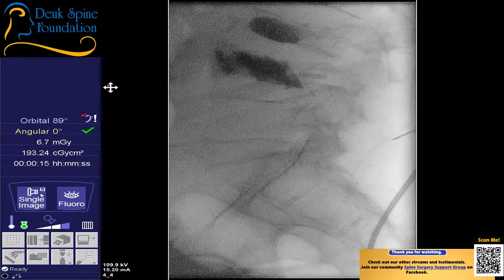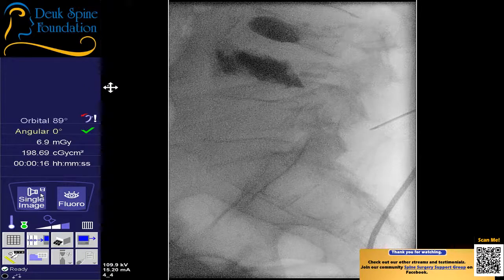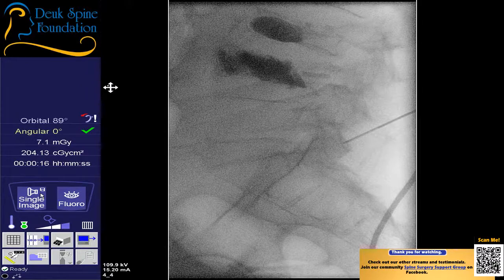Shot. Where do you feel that? Shot. Huh? All right, everything's okay. Shot.